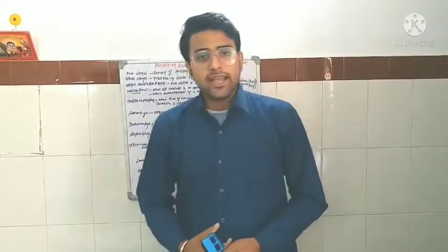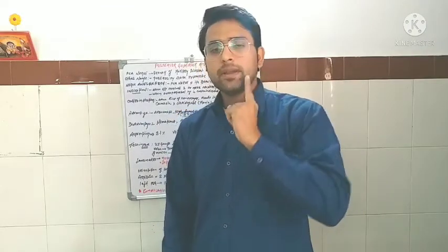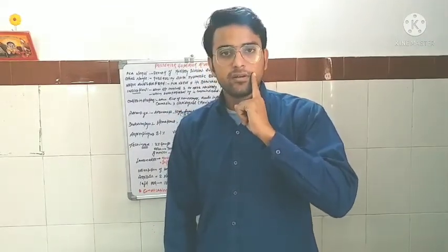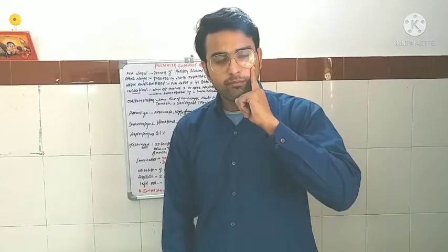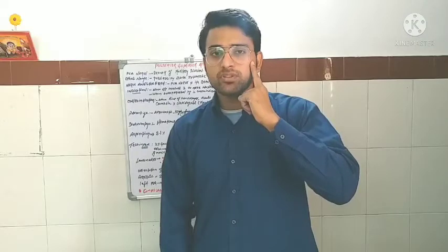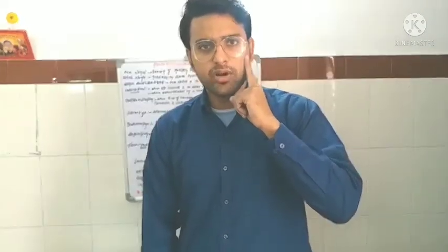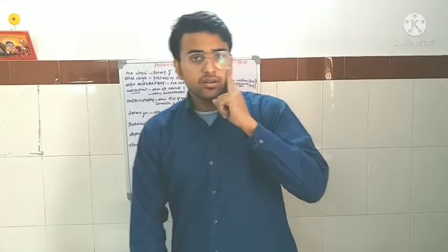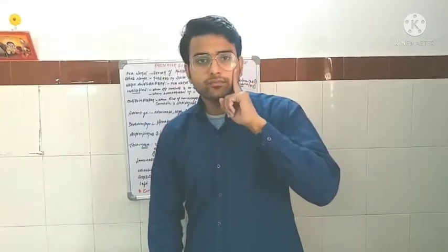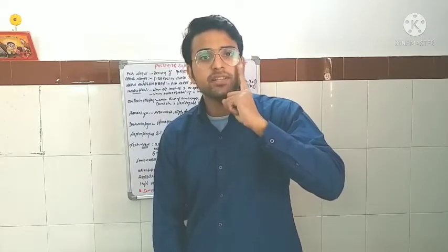Okay. Then coming to how you will know where you have to insert the needle. First, take the left hand forefinger, keep it in the bicuspid region, and move posteriorly backward to enter the zygomatic process of the maxilla, which will lie just above the maxillary second molar. After entering, just rotate your finger. I'm not keeping my finger inside the mouth, but in the patient's mouth you will keep it like this.